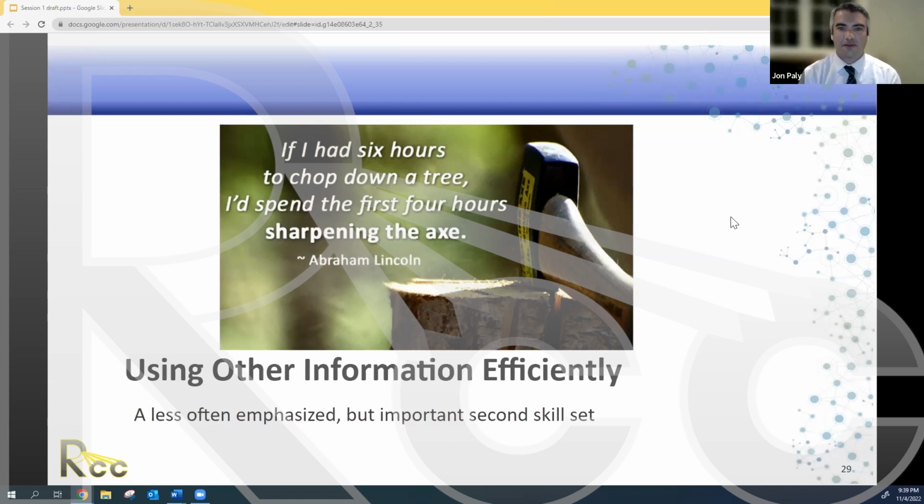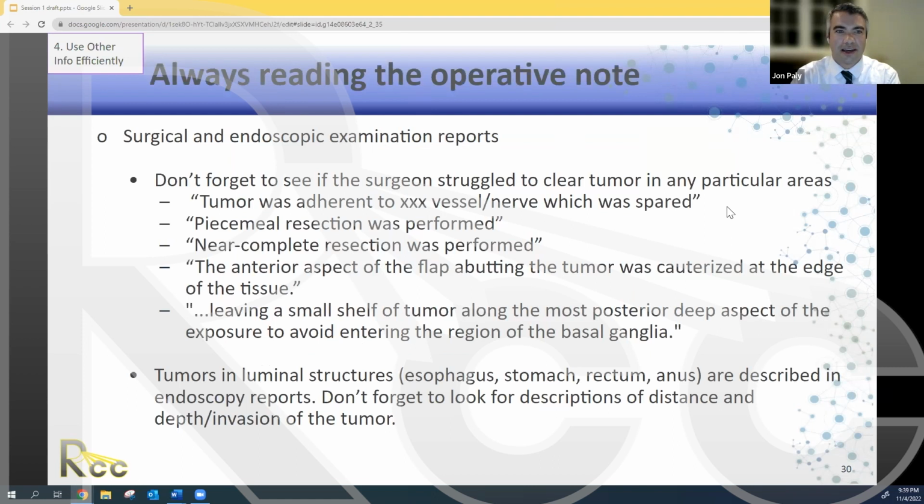If you have all of the information you need, you know what you're going to do, you know what expansions to use and what areas to contour, it will make the actual contouring much easier, and you'll be much less likely to go back afterward to try to figure out what's going on. So always good to start with that. So let's start sharpening that axe.